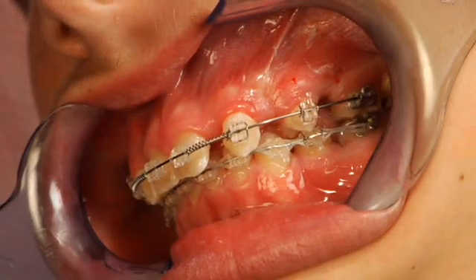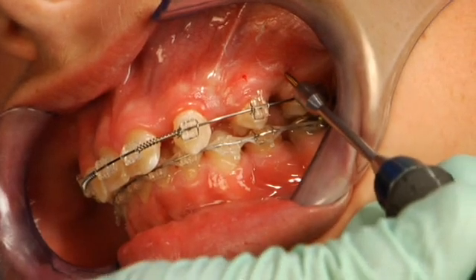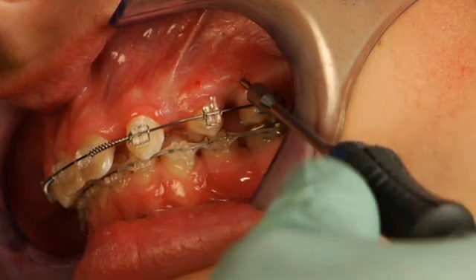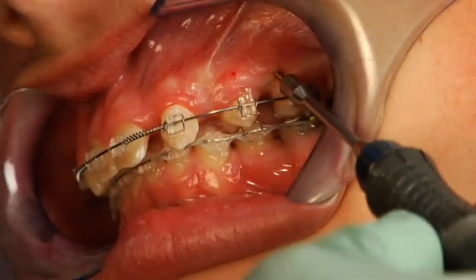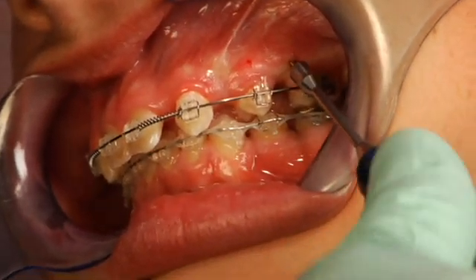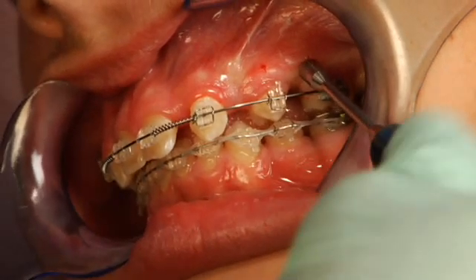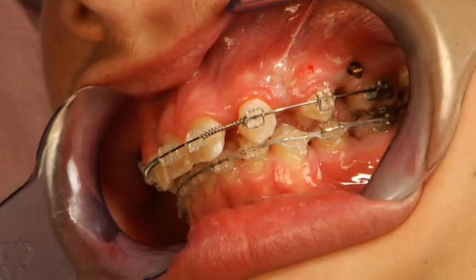Now we're going to go ahead and place the contralateral side — the same position, just at the mucogingival junction, mesial to the first molar. We initiate with a little pressure, and once again the threads catch the cortical bone and it very easily pulls its way in, getting the head closer to the tissue.